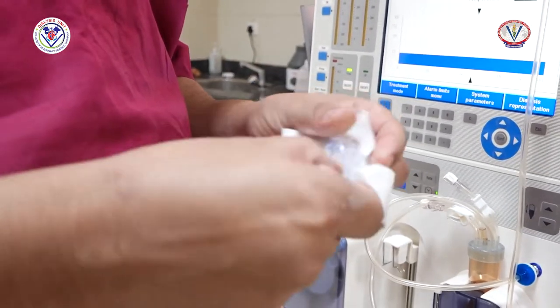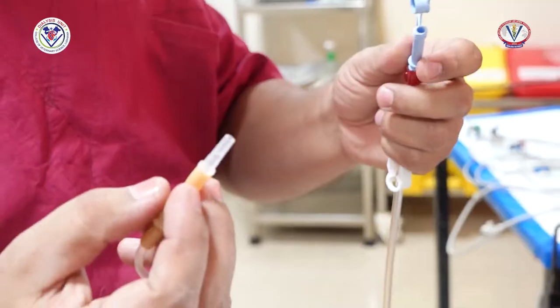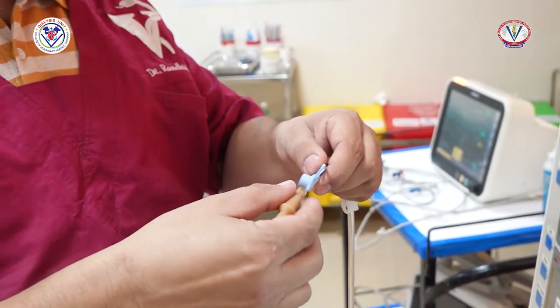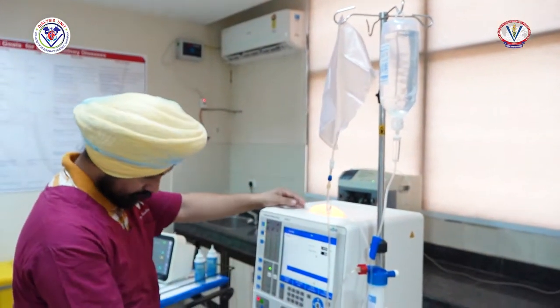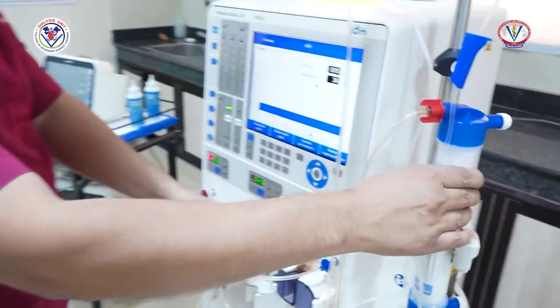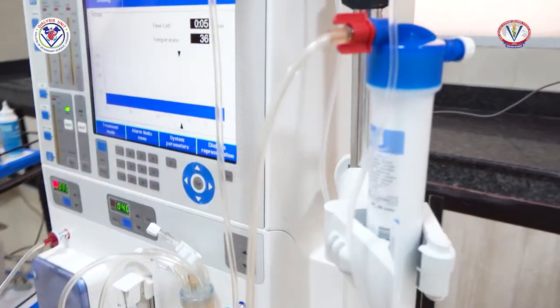Now connect the connector with one end of the arterial line and connect the other end of the connector with the IV line containing normal saline solution, which is ideally used for priming. The main purpose of priming with normal saline solution is to remove all the trapped air within the blood tubing and the dialyzer.